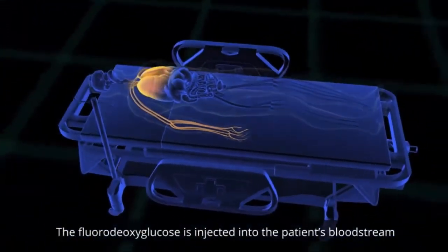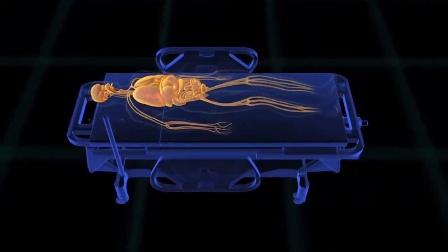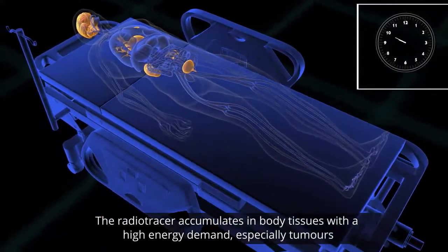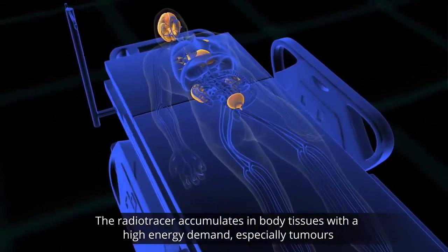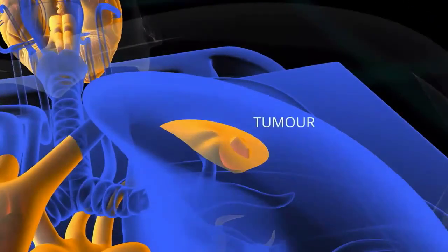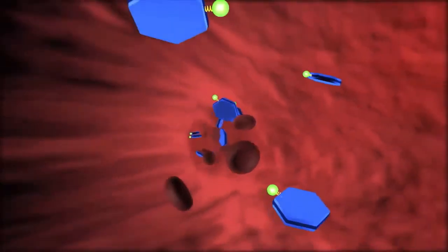Once it's injected, it takes a little bit of time to distribute throughout the entire body. And when you then wait, again, this is about imaging biological processes. In the case of FDG, for example, it goes to organs that are very high in glucose metabolism, and that's how the contrast in your PET image is created. In this case, you can look at tumor tissue.